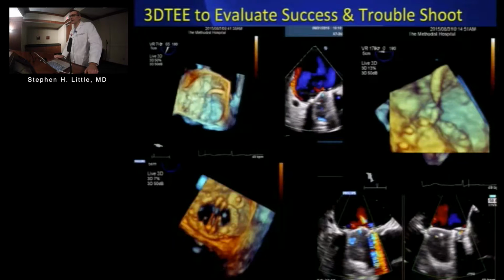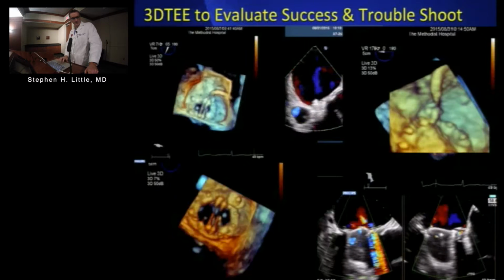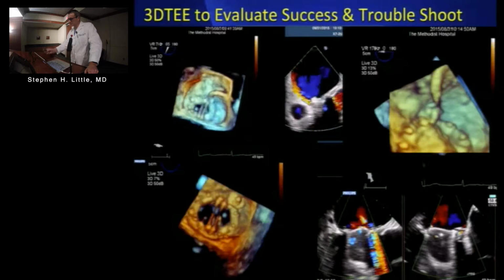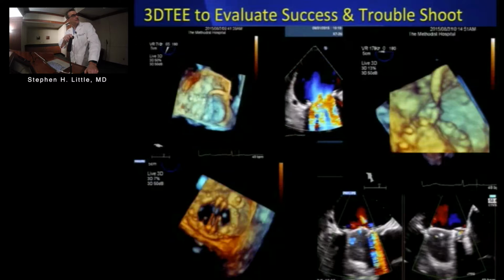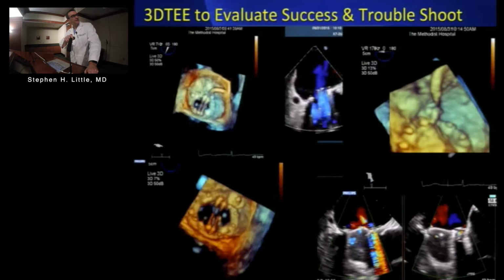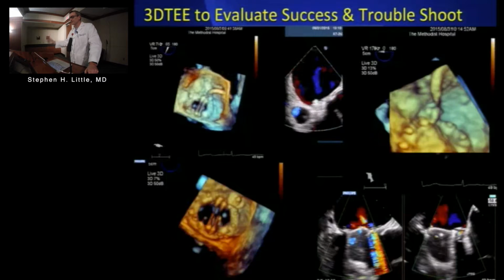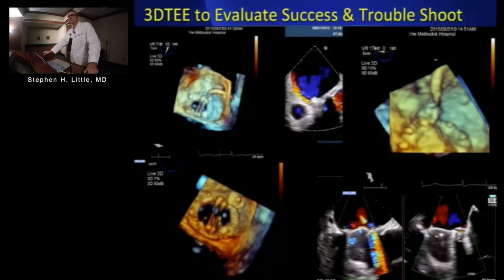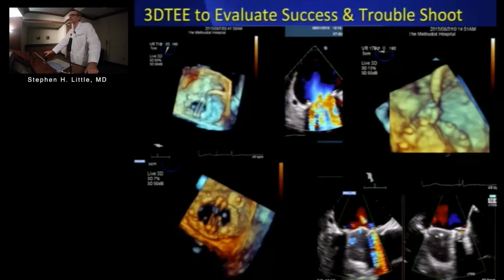So there was a guide wire still across the defect. The catheter is here. See if I can pull out, there it is, right there. It's just lifted up on the edge. So in fact, the guide wire was still across the defect, and the guide wire itself was lifting up the edge of the device. So communicated that to Dr. Barker, who said, hey, I think the wire is actually interfering with the device lying down flat. That's what it looks like on a live 3D echo.